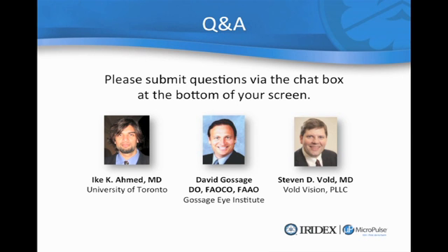The eye is unbelievably quiet. That was probably the first thing I remarked, and I honestly had questions, and I still will have a critical eye on this as far as am I going to get a response? I don't see much going on in the eye. When we're doing SLT or certainly with ALT, we're seeing blanching or micro champagne bubbles, and we're seeing some cells in the AC, and quietness really took me to this one. So I'm looking forward to our results.